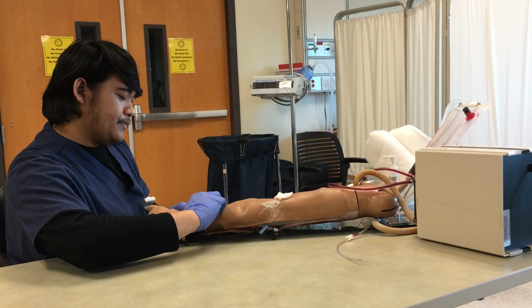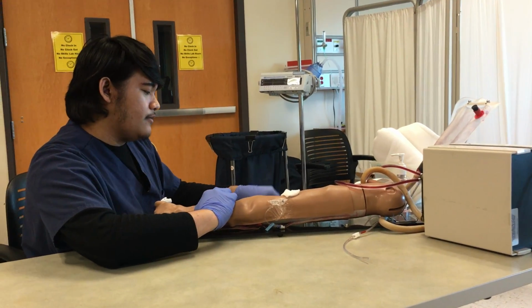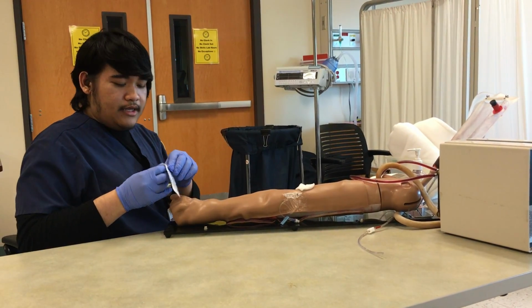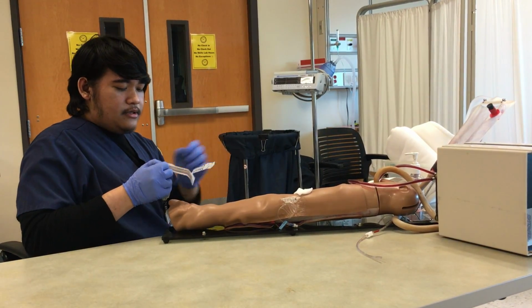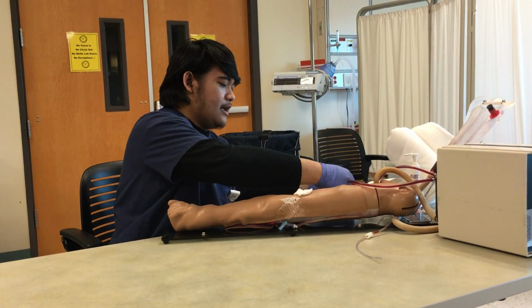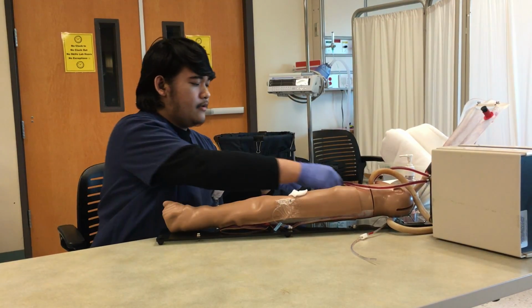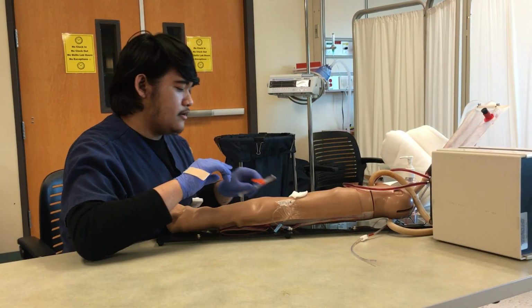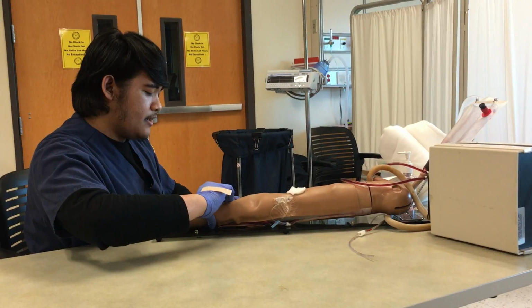So I would feel for the radial pulse, and once I feel the radial pulse, I would go ahead and start with the procedure. So I'll take this out, and this is a technique that I saw in one of the clinical sites that I went to. It's an easy access for them for later on. So I would feel for that.